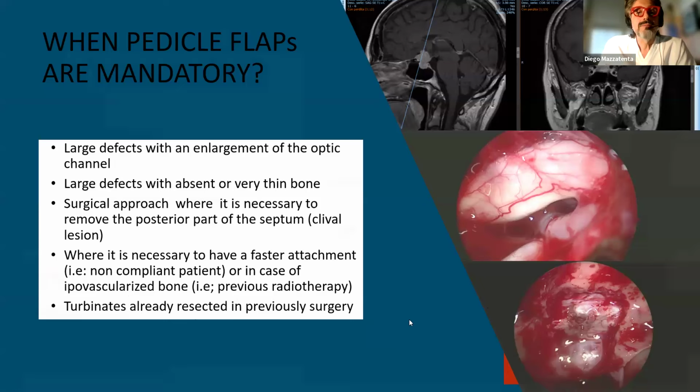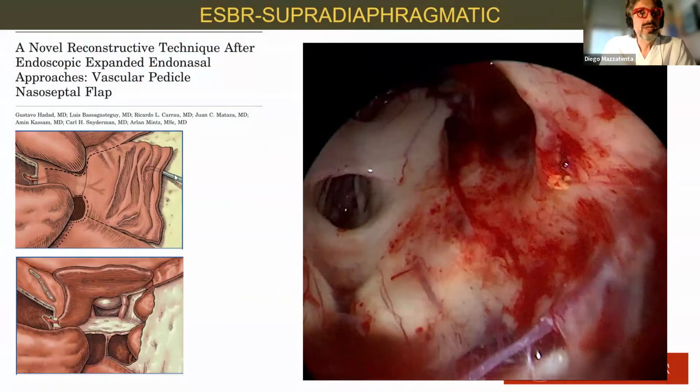And as you can see, this schema shows the technique to prepare the nasal septum flap.